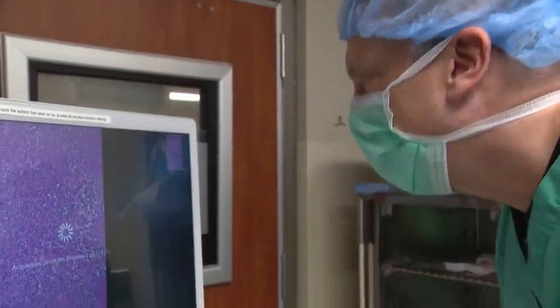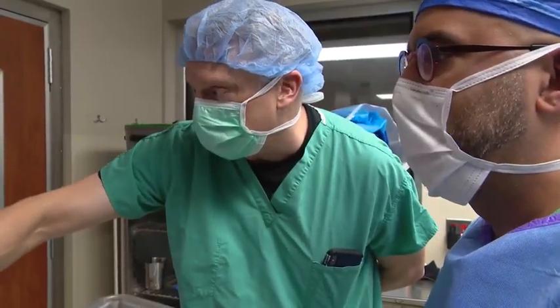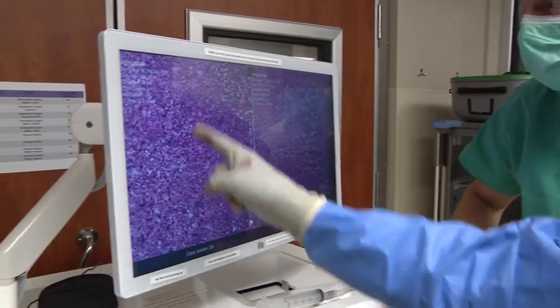Neuropathologist Dr. Craig Horbinski stopped by to see the new technology in action. So the surgeon is right there, the image is right there in the operating room. It's a matter of learning, okay, what does normal tissue look like versus abnormal tissue, and then just keep digging until you hit normal tissue and then you stop. I mean, that's where the real strength of this lies.